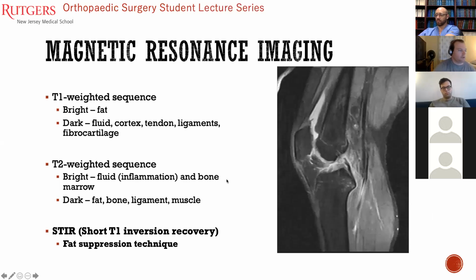And then there's also a third imaging. It's called the STIR sequence, short for short T1 inversion recovery. This is similar to a T2, but there's also fat suppression involved. Again, this is something that's more used for looking at oncologic imaging issues, being able to classify different tumors and their consistency, which is something we'll get into a little later in a separate lecture about orthopedic oncologic imaging.